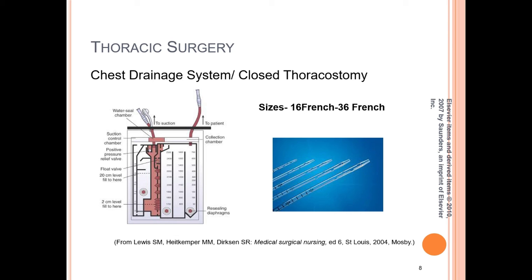Other helpful hints are that the chest tube should not be clamped during patient transport unless the chest drainage system becomes disrupted during patient movement, and then only if there is no air leak. The chest tube should only be clamped with a physician's order.